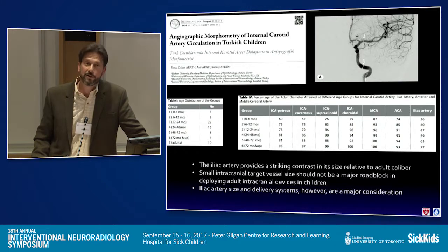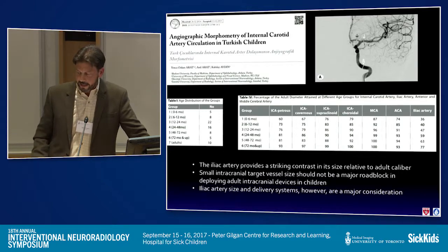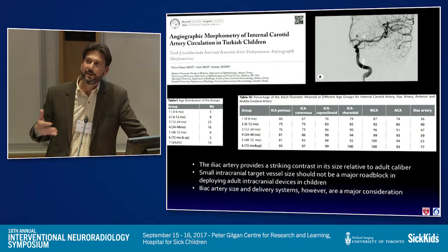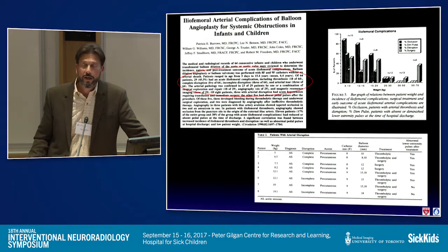However, that is definitely not true of your access, right? So of course, and we know that from looking at the legs of the child, the iliac artery grows much more slowly, and you can't count on adult type of access to do these procedures. And you certainly cannot just ignore the femoral access.